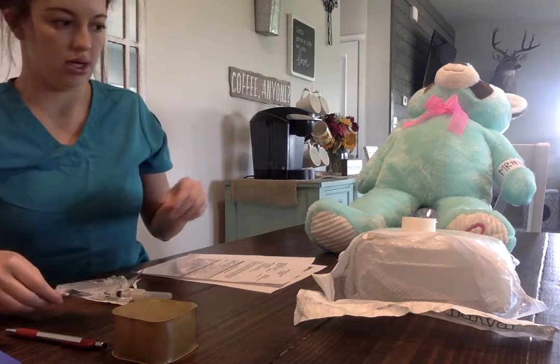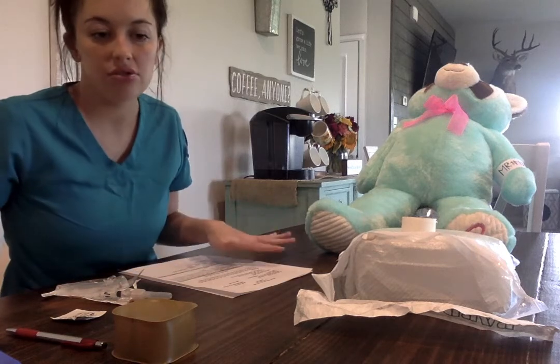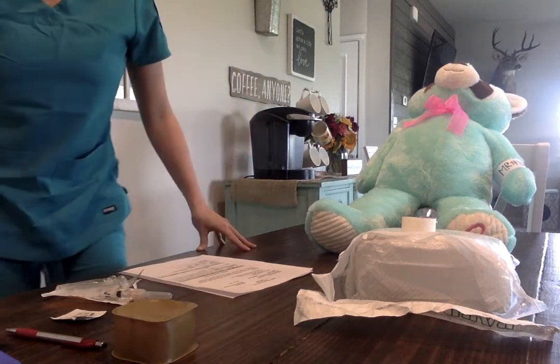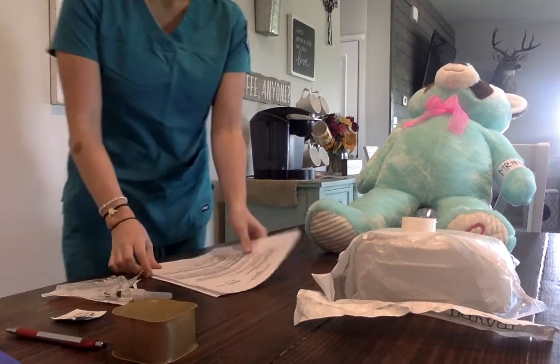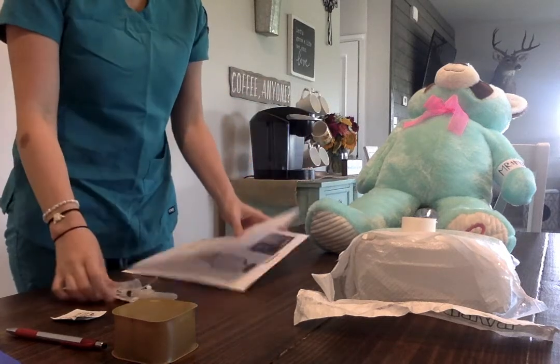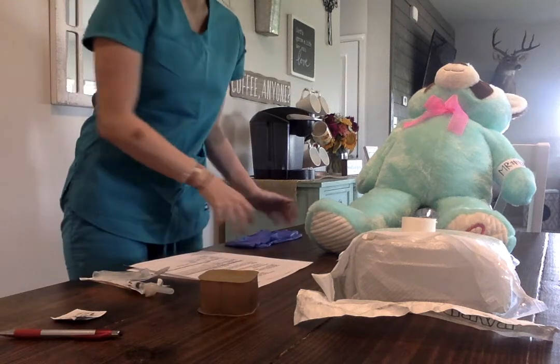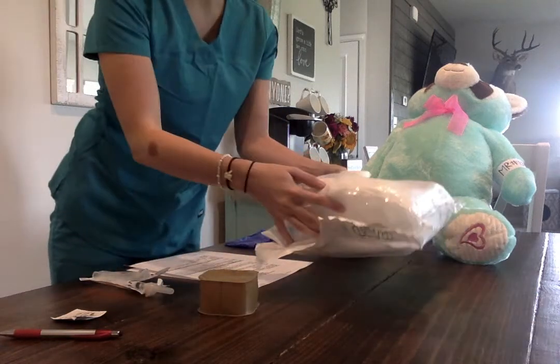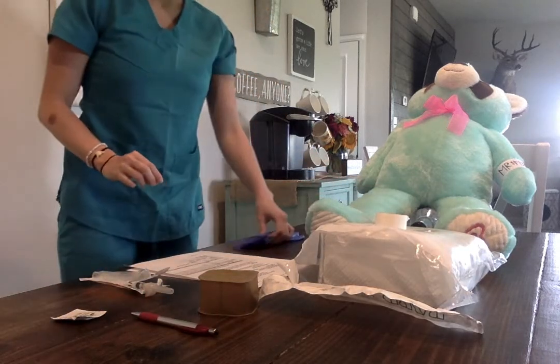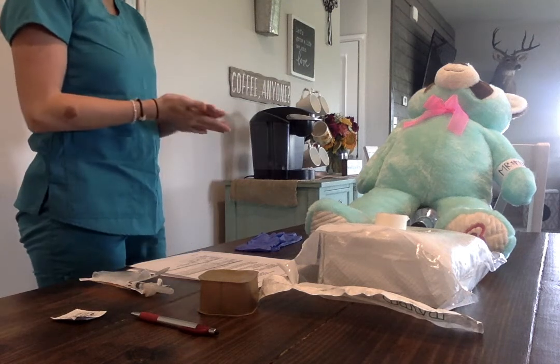Okay, so I have gathered everything, now I'm ready to enter the room. I have double checked my doctor's orders. I have gathered my supplies. And I am going to enter the room. Knock, knock, knock. Closed door for privacy. Hand hygiene.